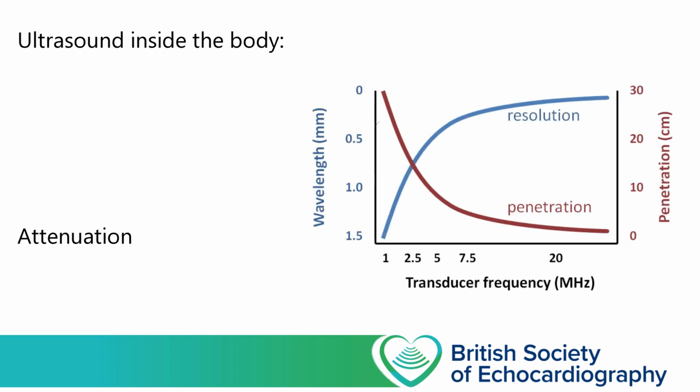So if we choose to use a high transmitted frequency with a short wavelength, we're going to observe superior resolution, but the cost is that we get less penetration, as attenuation happens at a faster rate. In practical terms, if you're trying to image deep structures, say a depth of 20 centimeters, there's little point using a transmitted frequency in the range of 10 million Hz, as the attenuation will be so great that so little energy will return to the probe, such that you won't be able to produce a usable image.